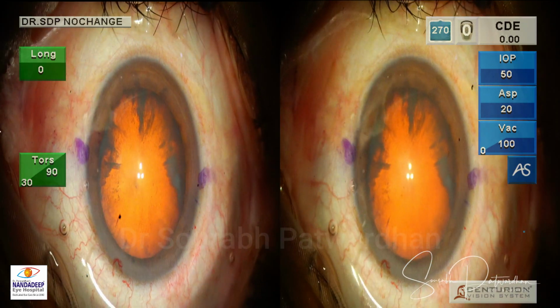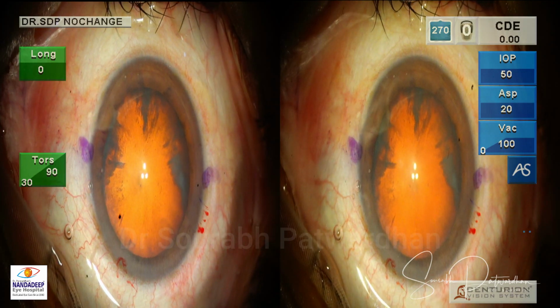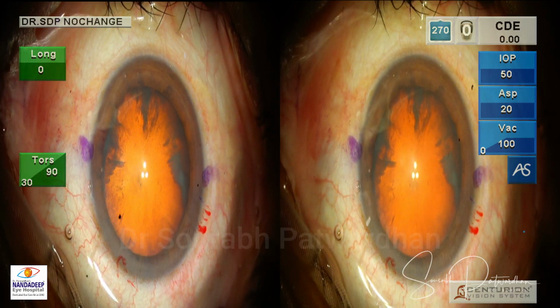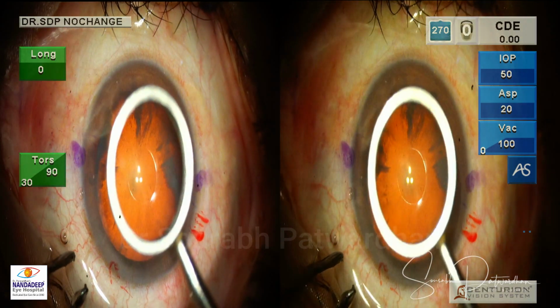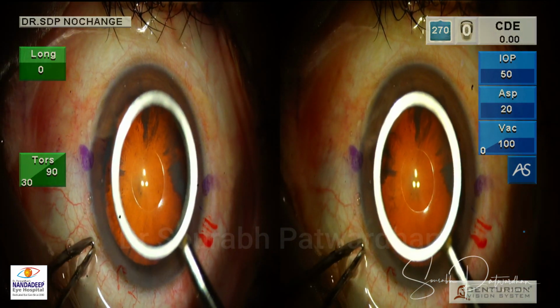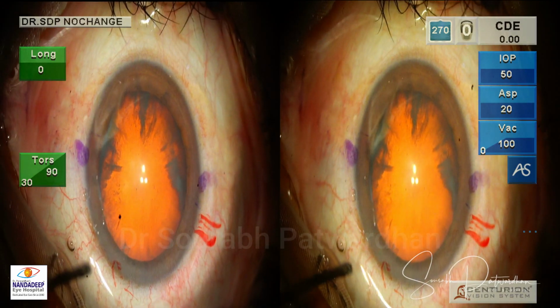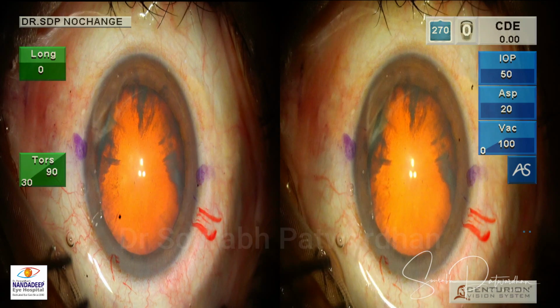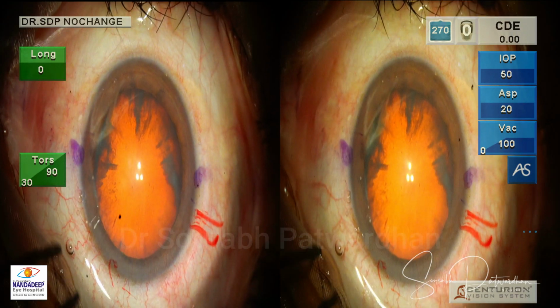CCC marker, please. I will just show you the manual way of marking the rexis also, because though Callisto also gives that, you can simply mark it, just center it around. This is too big. Yeah.